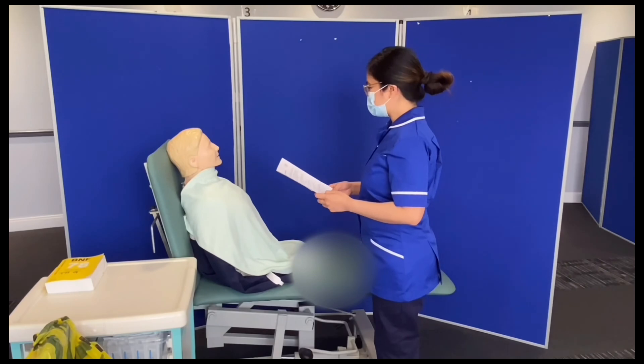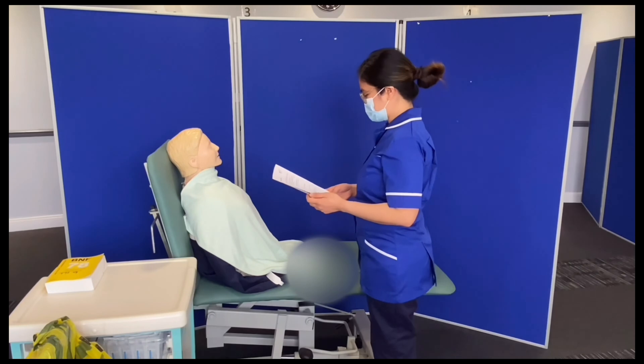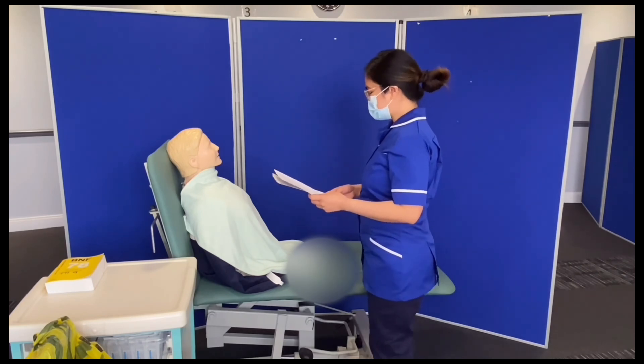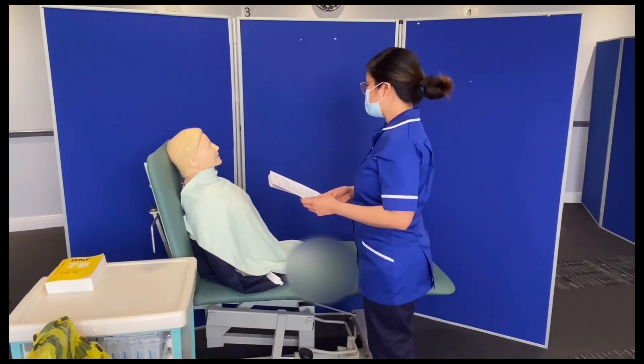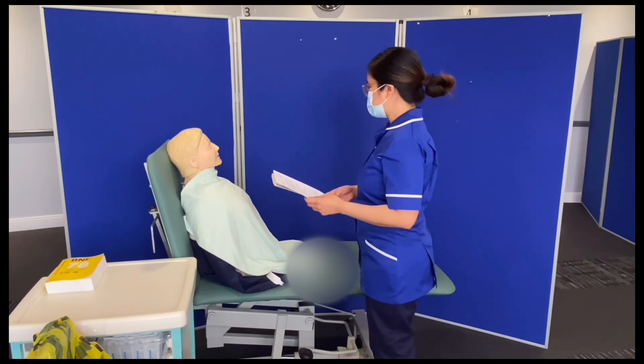Hello Jennifer, good afternoon. Good afternoon. My name is Paula, I'm your nurse for this afternoon. Hello Paula. I'm here, Jennifer, to check your blood sugar level for 2 o'clock as ordered by your doctor, if that's okay with you.